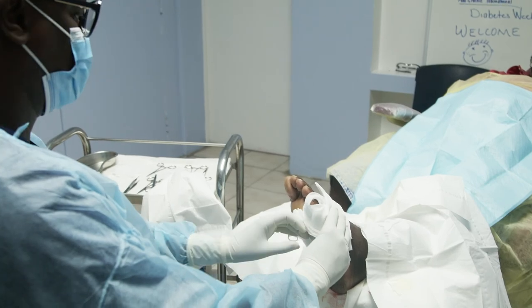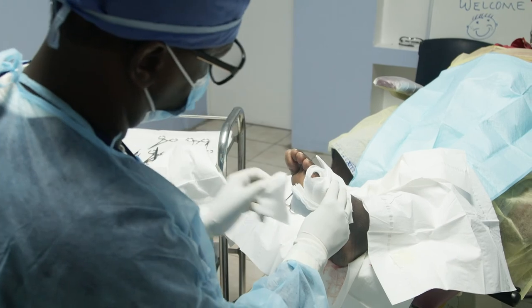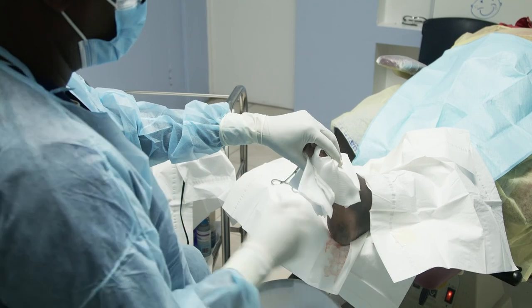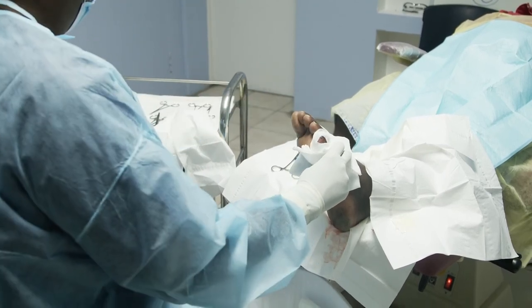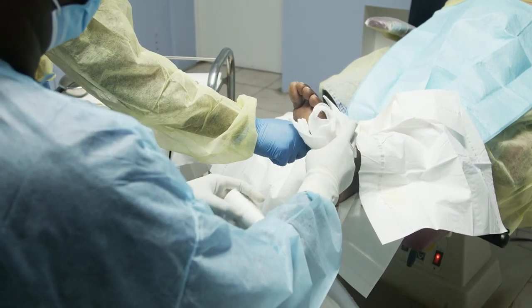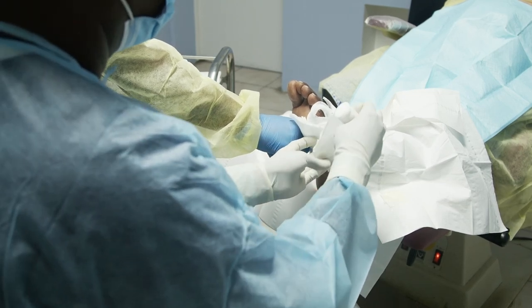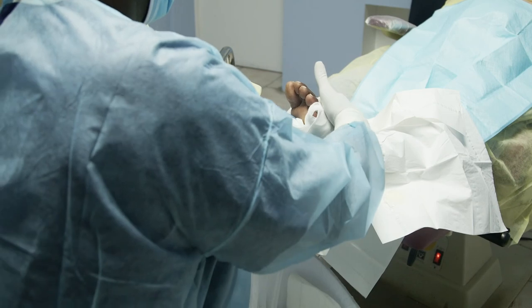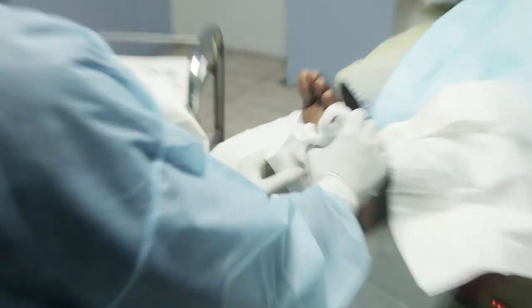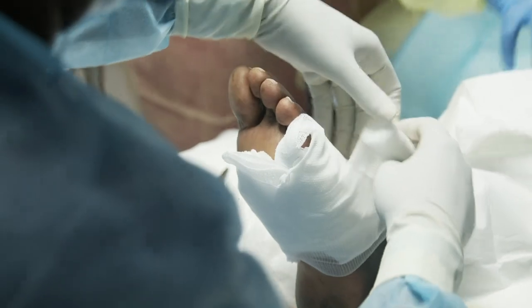Okay, I like to share one. I like to put a diamond on the bottom of the foot every time I do one of these procedures because I really think that's our protective measure. And we treat these feet like gold. Hold the bottom out for me, please, Felicia. Put your finger right there. Good. Everything will stay in its proper place. Well, I got all this to behave in one spot. There we go. One. Got it. We have a post-op shoe his size.